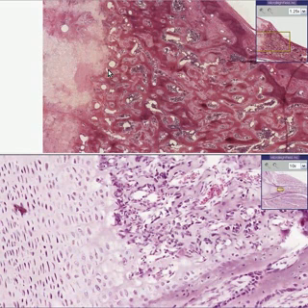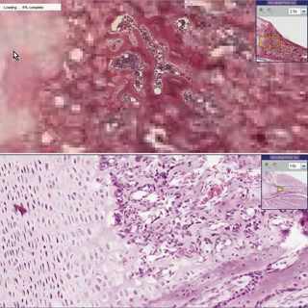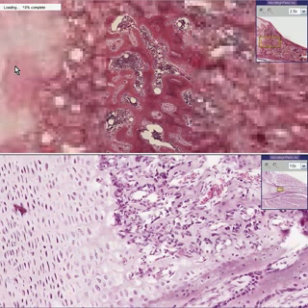But what we can tell, however, is the fact that here in the zone of cartilage, you don't really see much by way of cartilaginous tissue.